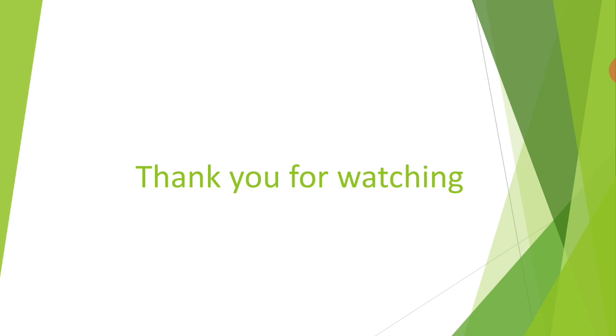Okay? And the patient should also try to learn how to use the device from the prescription you gave, like any other skill, learning to read with low vision devices requires regular practice over many weeks. So they need to practice and adjust until they enhance their ability to use the low vision devices.